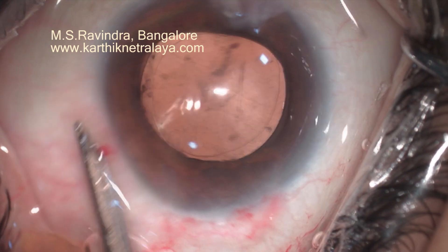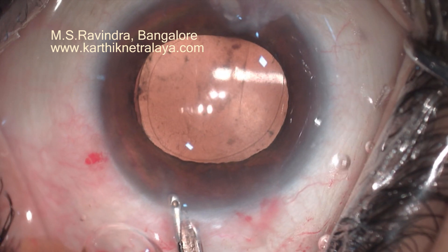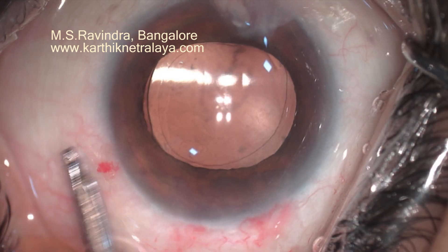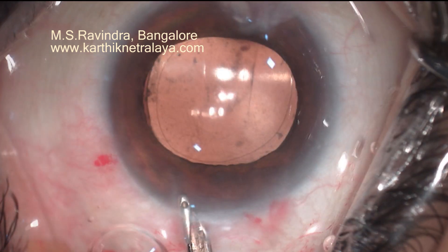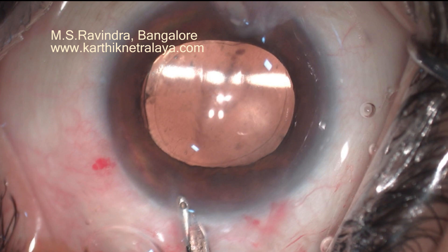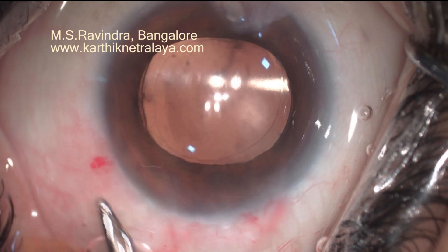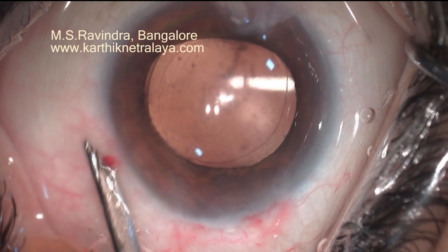The fluid balance was very well maintained between the anterior and posterior segments. Watch on the right side — the fluid wave is traveling across and meeting another fluid wave coming from the other direction. Let us see it slowly. At the 4 o'clock position the fluid wave starts and goes to the left, obstructing the silicon oil shimmering.